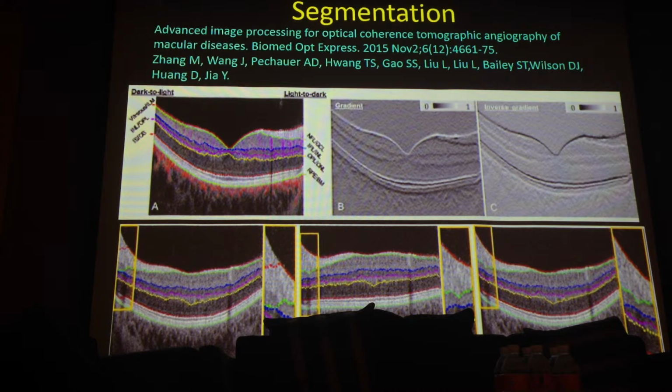Segmentation is a very high technology, working very well when you have a perfect retina with differentiation of the different layers; then this segmentation works with every machine. But when you have some disturbance of the layers, the technology is not sufficient. It's not at a level to separate a few different situations.